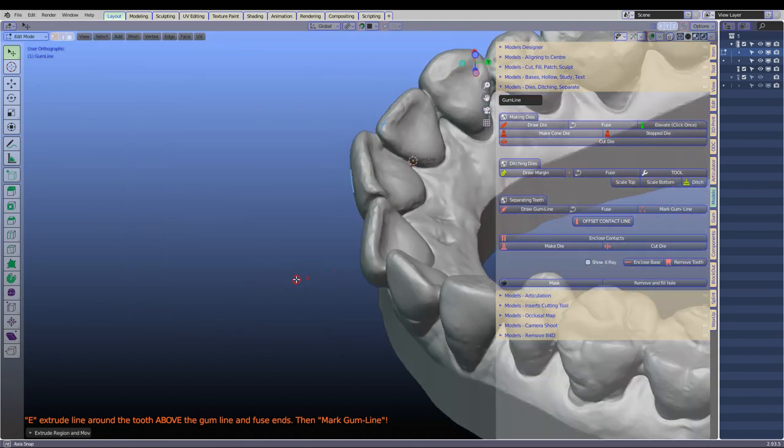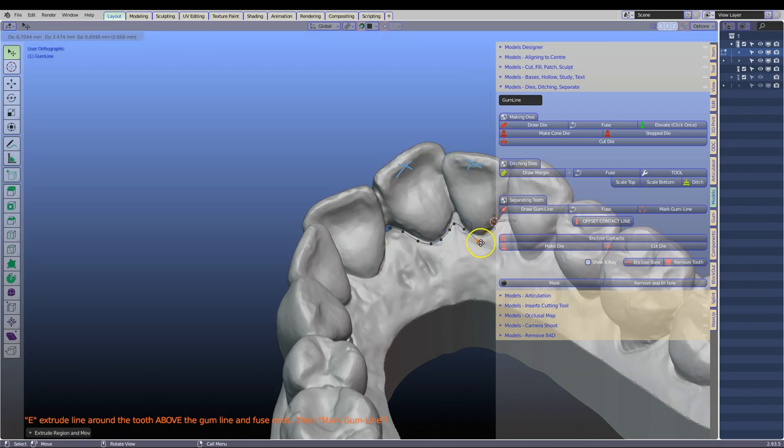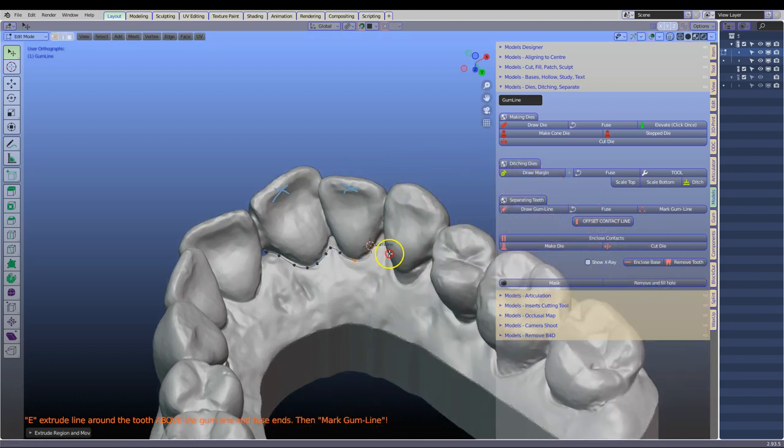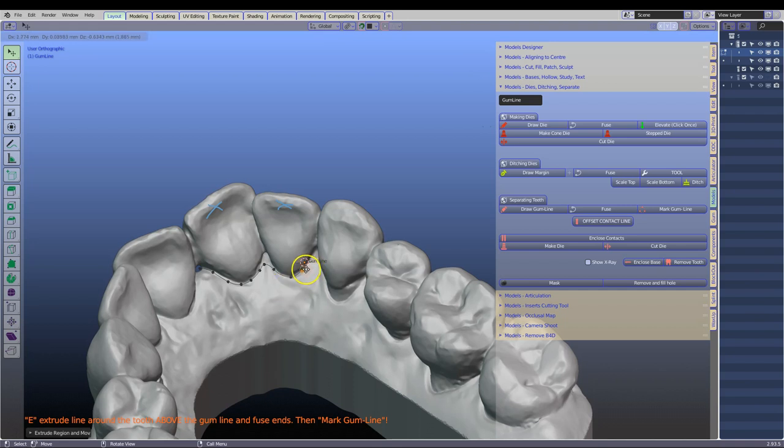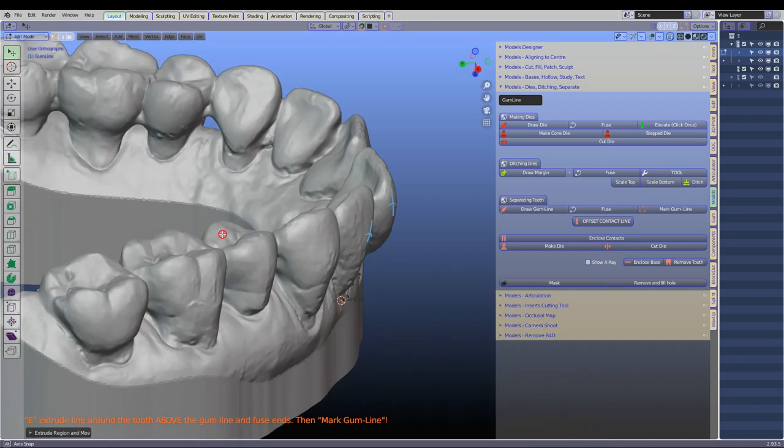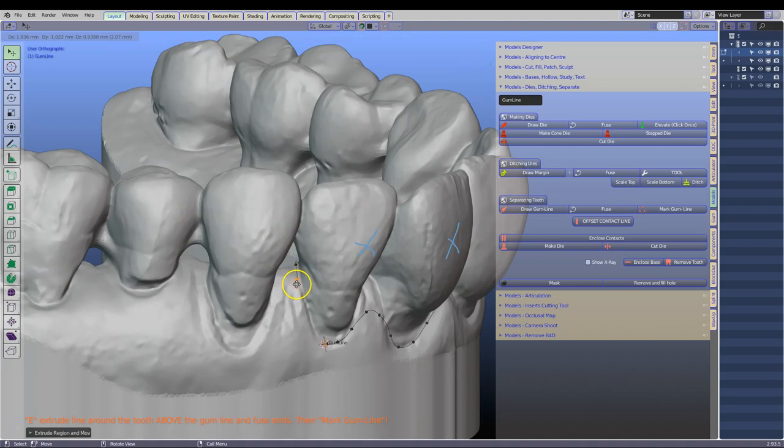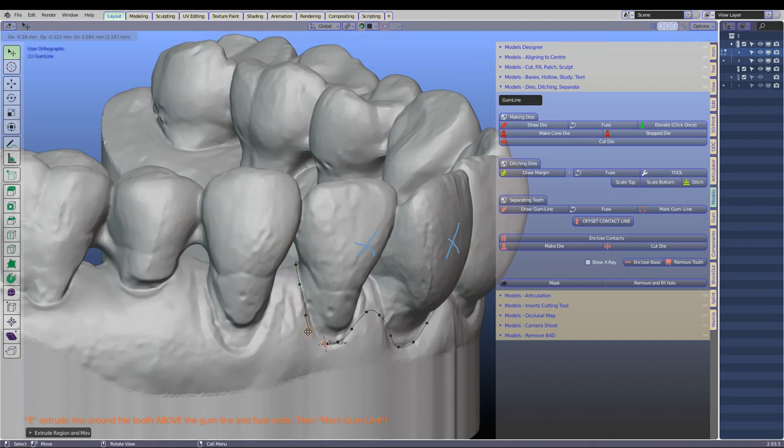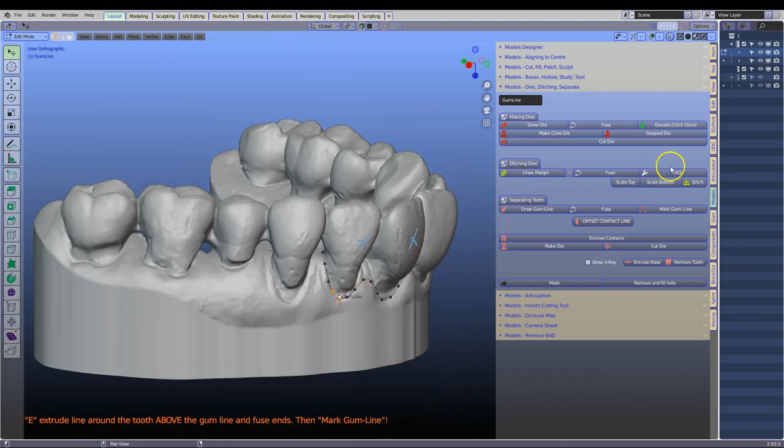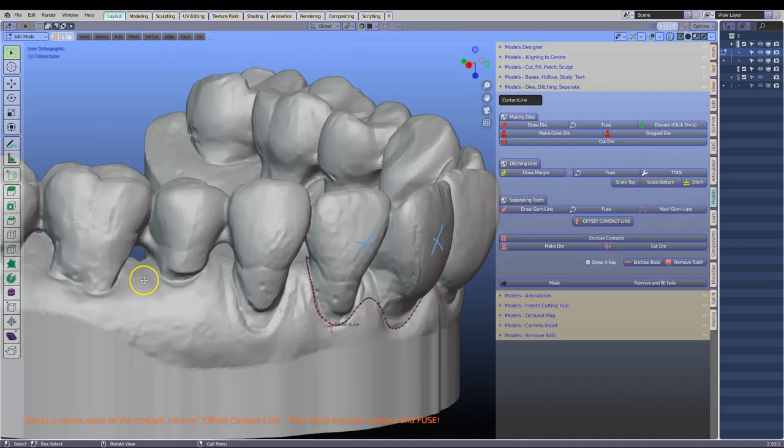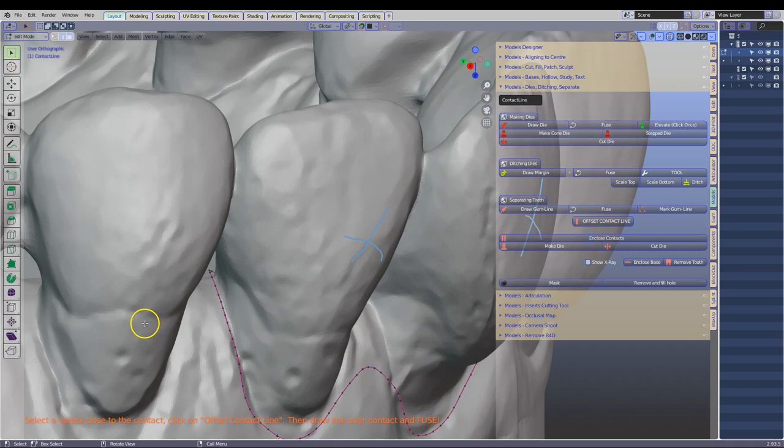Also by going through the contact area. I don't want to have any sharp lines while we are doing this. So no deep crevices like that, just smooth lines. We get to the other side. Shift, left click and F to fuse and then mark the gum line. That should then go pink.